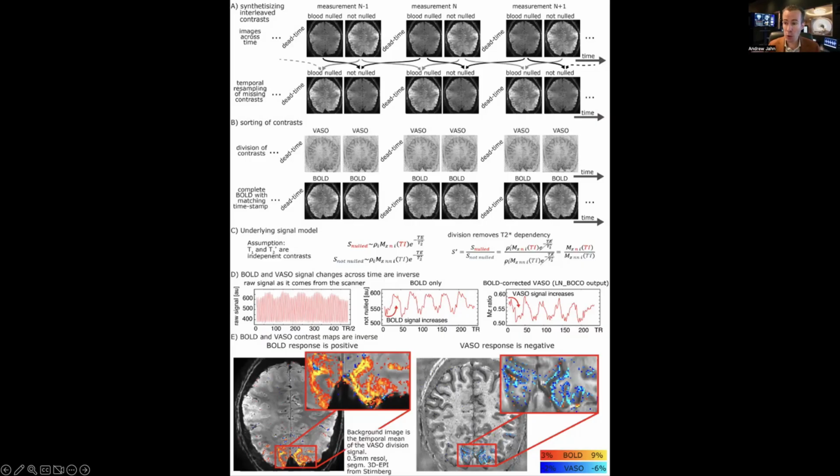So if we know the T1 weight of the blood, and if it's distinguished from, say, the tissue itself, we can have a pretty good idea where there's more tissue activation as opposed to maybe activation that's being spuriously located in the veins.